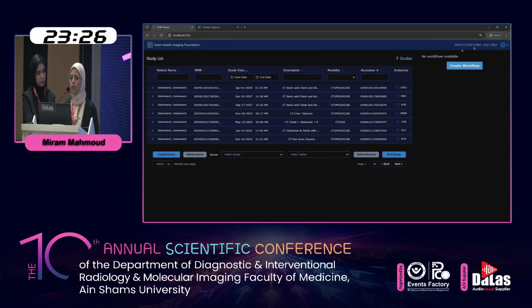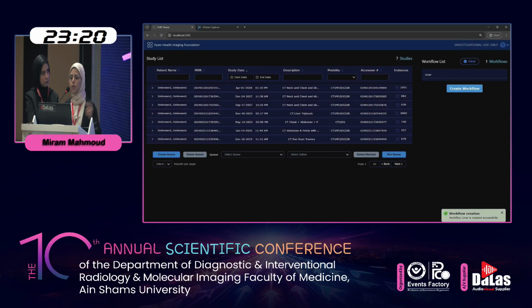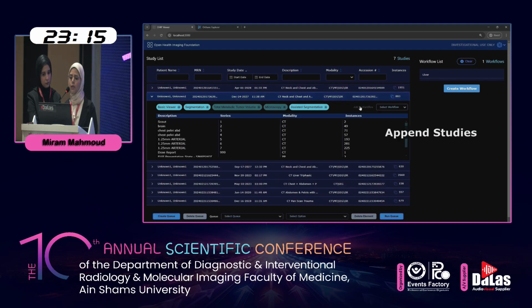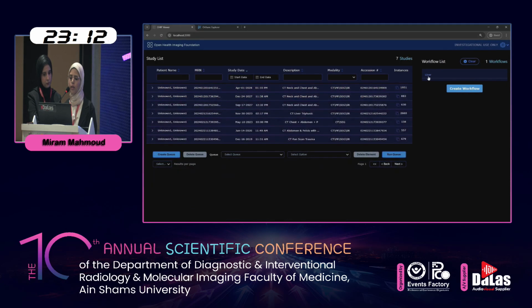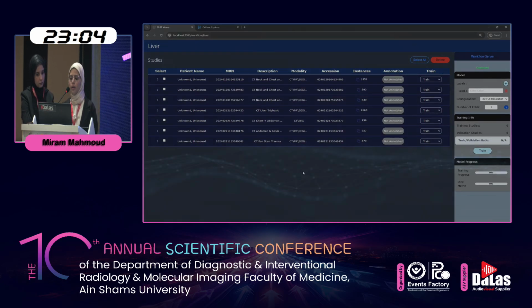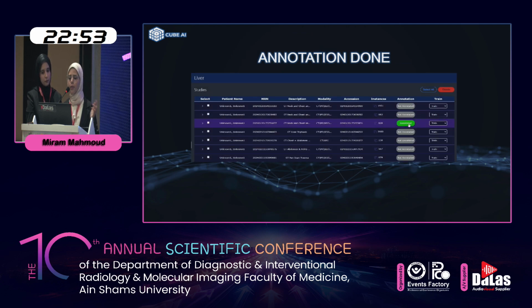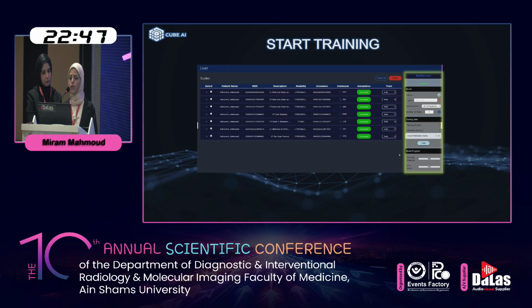First, we create a workflow and name it, say liver, this is the name of our model. So the model will be trained to segment liver only. And then we need to select multiple studies to add to the workflow. Now the studies have been added, and we will notice that they aren't annotated yet. So we will use the assisted segmentation tools and features we have mentioned before. So we can generate segmentations, create labels, and name them. And now our data becomes annotated. We will repeat the steps for the remaining studies. And now we can start the training.